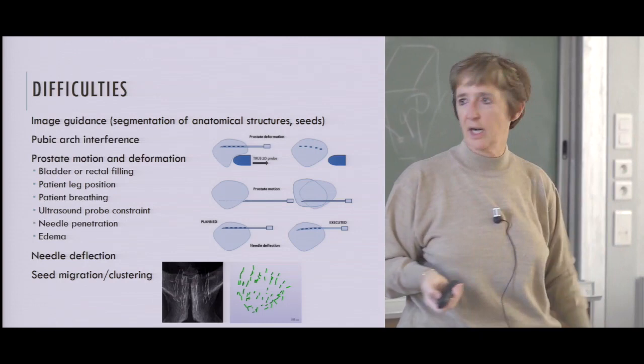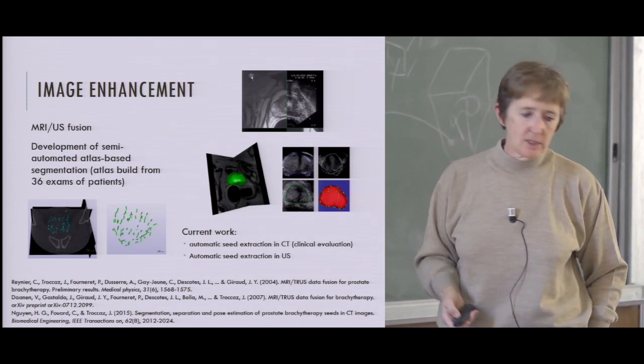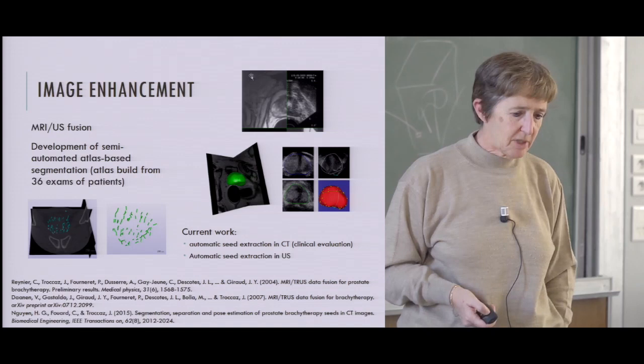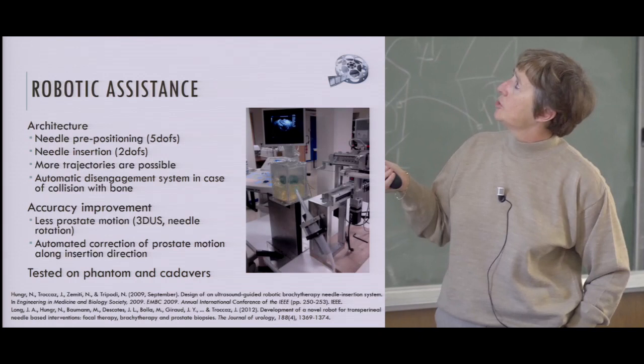And so we developed many assistants to help with that. First, we developed image processing tools. I will not go into the details, but some of them were also transferred to the company to make the treatment of the ultrasound or MR images easier. But we also developed a robot that you can see here. I will just show you a small video so that you see the movement of it.